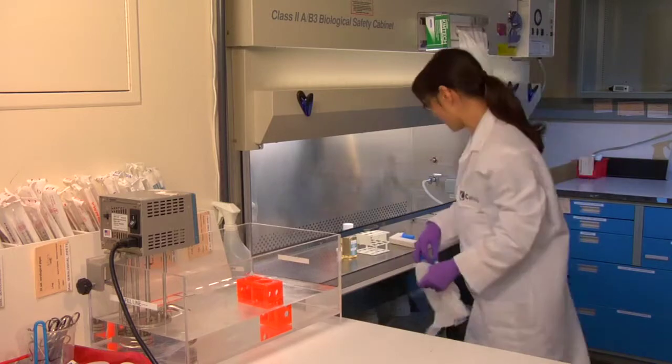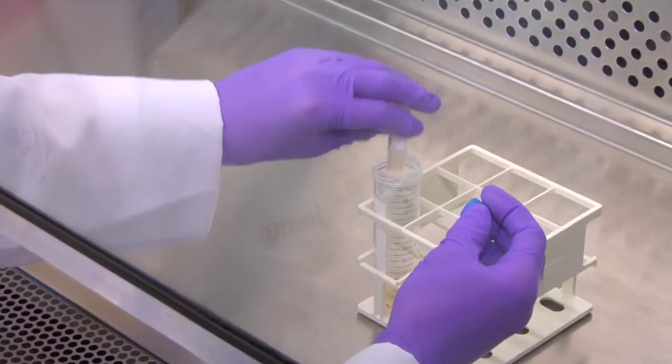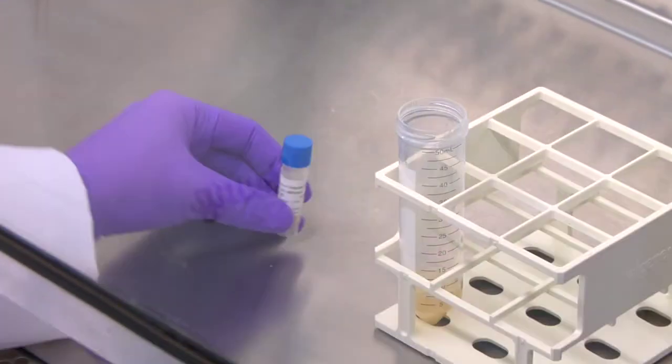Wipe the vial with a kimwipe and take the vial to the biological safety cabinet. Pour the vial into the 50 milliliter conical tube of pre-warmed InVitroGRO CP medium.